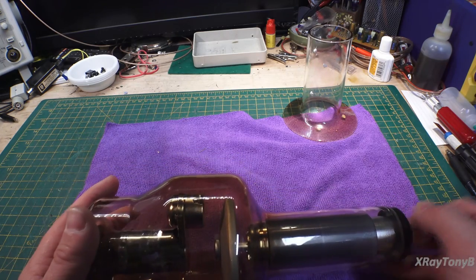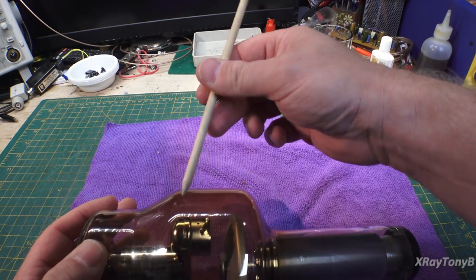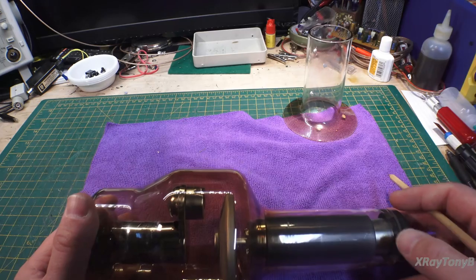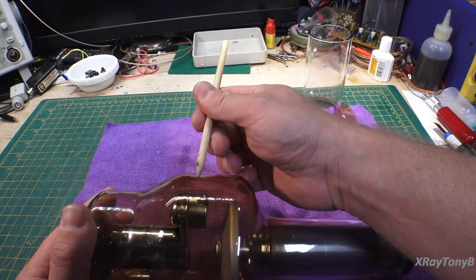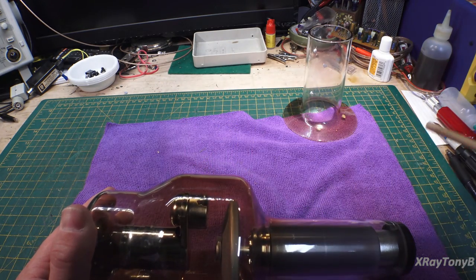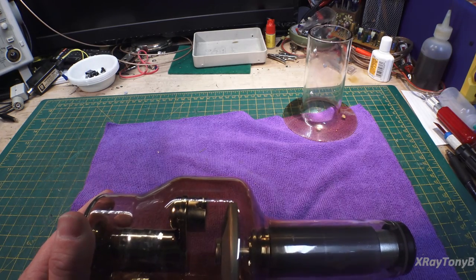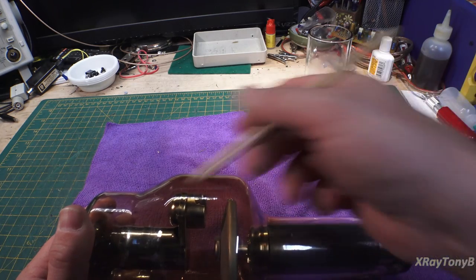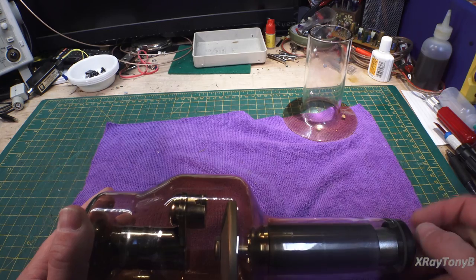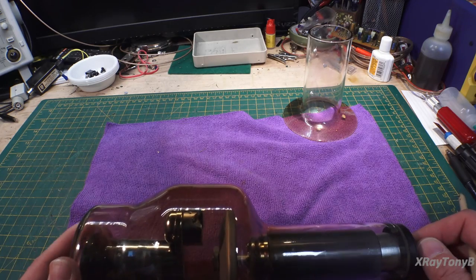And you can see your anode is right here, and then this little cup that's in here is called your focus cup, and that's actually your cathode. So you can see how large of a space there is between the cathode and the anode. If you were to look inside of a vacuum tube out of your radio or your guitar amplifier or whatever, these two elements would be much, much closer together. The reason you have to have that distance is because of the high voltage potential that we're applying across this tube. And again, I'm not going to get a whole lot into x-ray theory on this one. Video number two, I will get into that, part two.